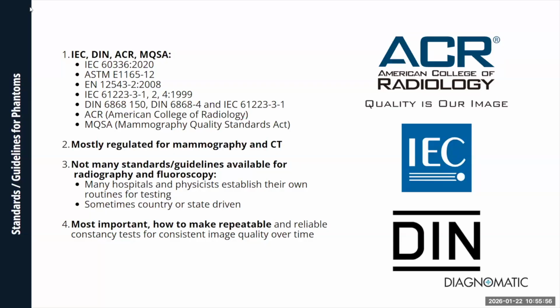The most regulated areas are mammography and CT. For those two kinds of medical devices, the regulations usually are the most strict and the most demanding. And not many standards or guidelines are available for radiography and fluoroscopy. That's why medical physicists, hospitals, and people responsible for quality assurance use their own routines for testing.